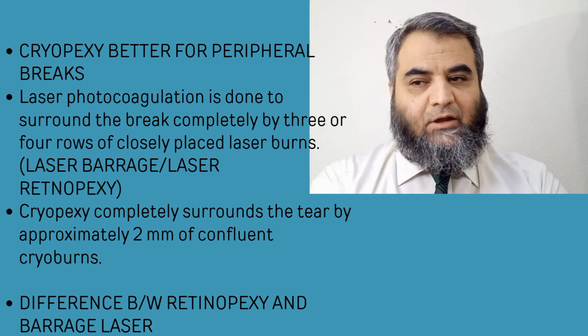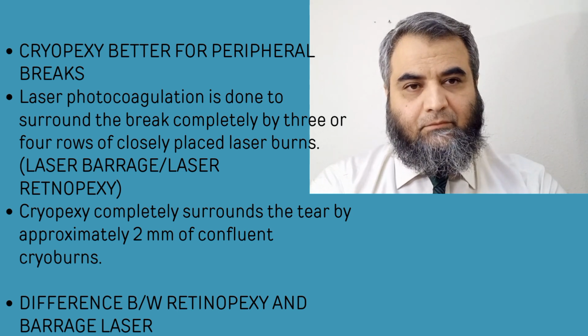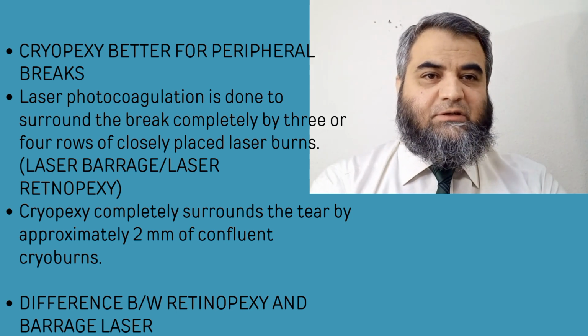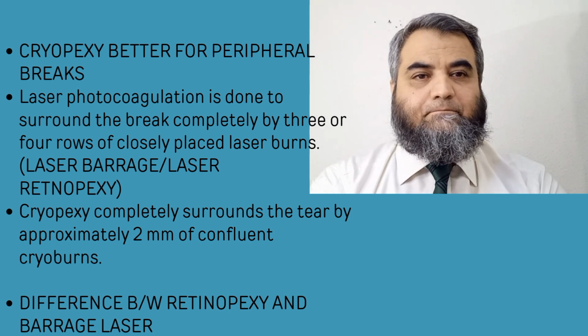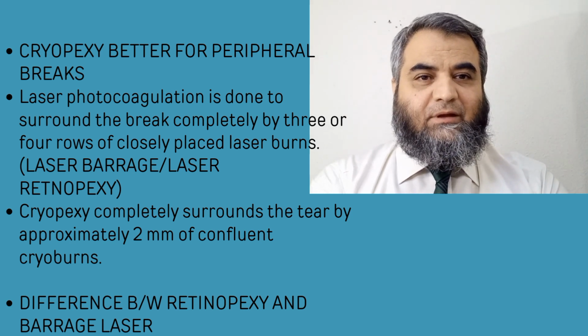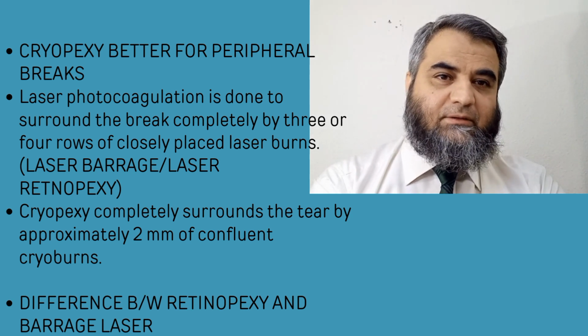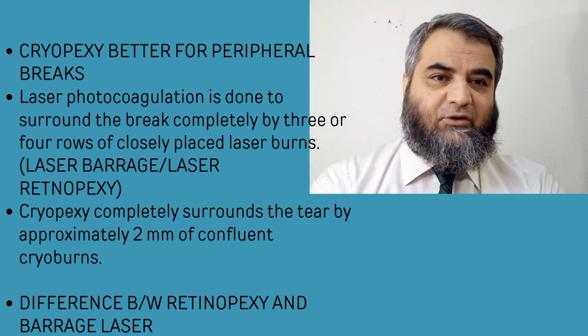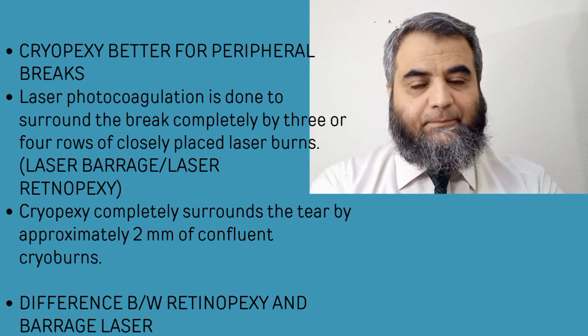It is applied as approximately 2 millimeter confluent cryoburns, and cryopexy is especially important for very anterior retinal breaks, which are difficult to be handled by indirect laser. And one more thing: if a retinal break is surrounded by a margin of subretinal fluid, it is called laser barrage. But if the margins are dry, we call it laser retinopexy.